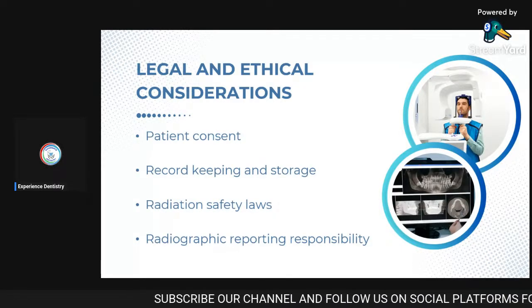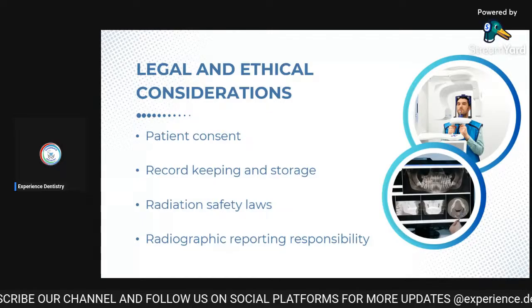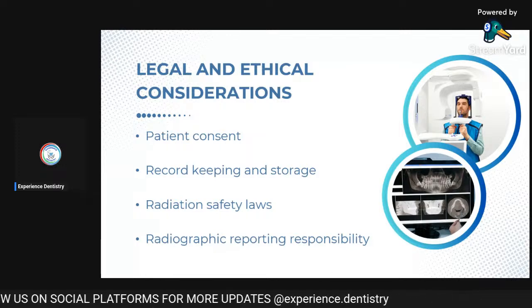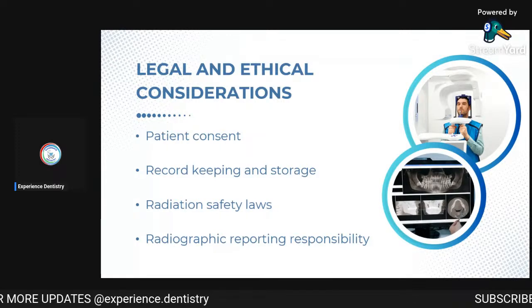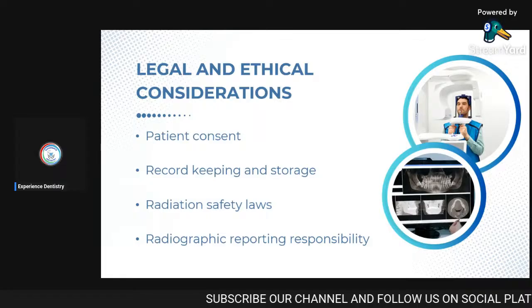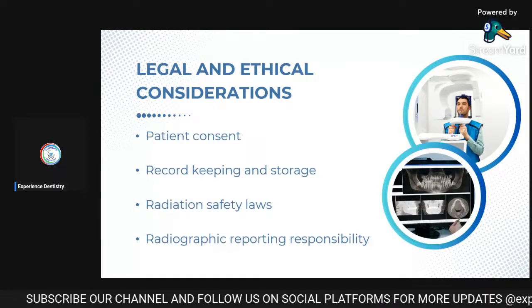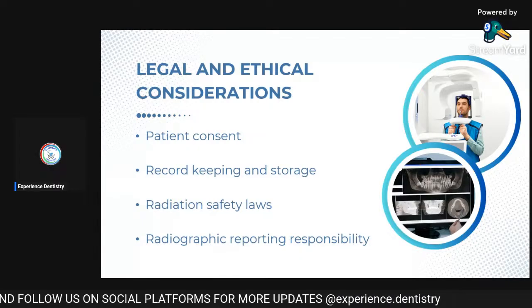Legal and ethical considerations regarding radiography are that you need to take consent from the patient first. Whenever you are taking an X-ray, you have to ask, I will be placing a film in your mouth, can I do it? This is for the purpose of a diagnostic procedure, and you have to explain it. Similarly for the sensor, when you are taking a digital radiograph, you need to explain it. And for the OPG as well, you have to explain the instructions.